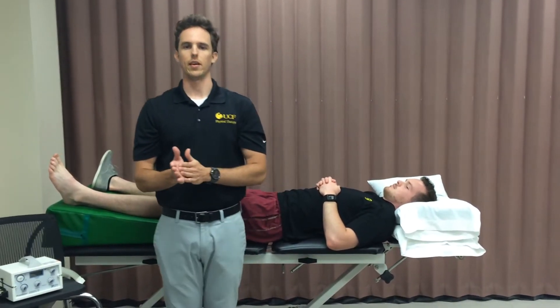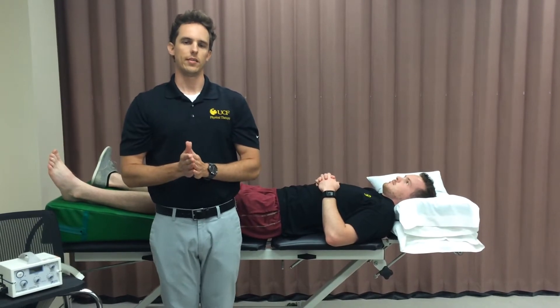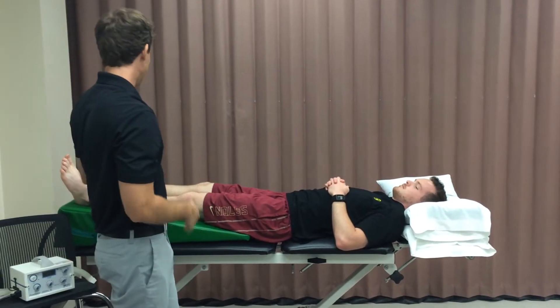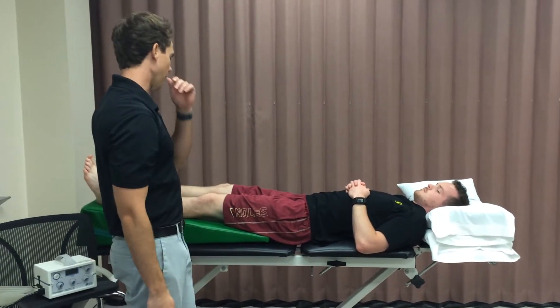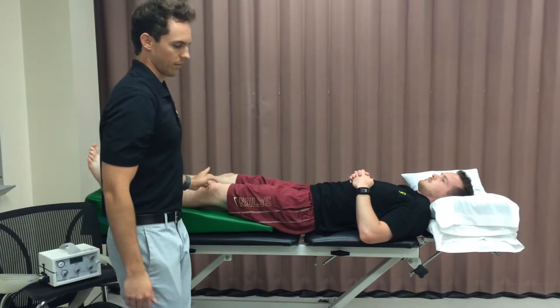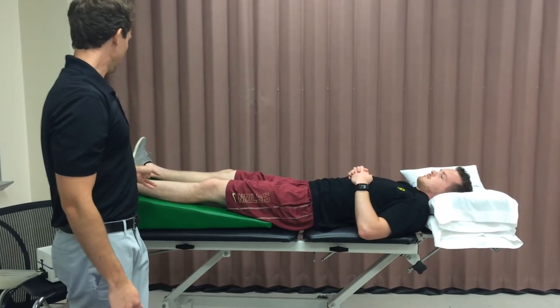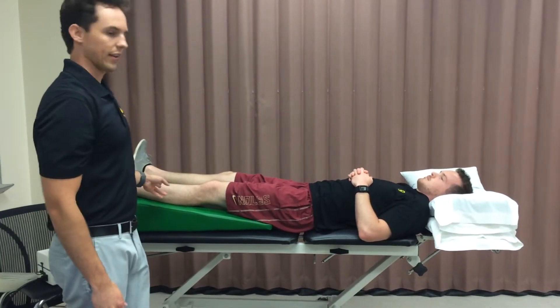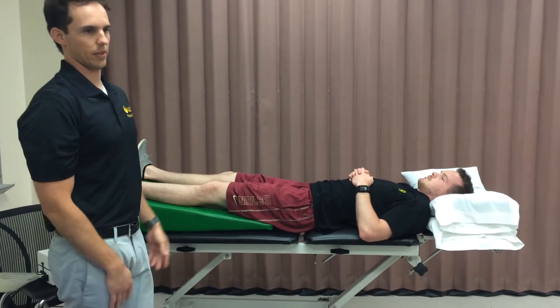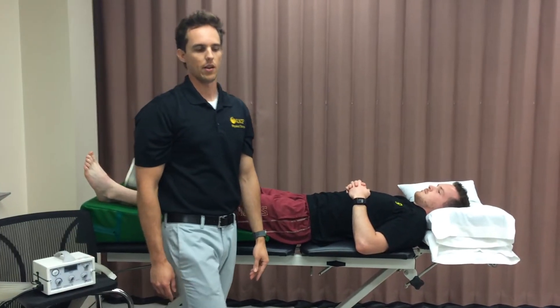What this compression device will do is help increase the venous return through the leg. Therefore, it helps prevent venous stasis in this leg, ultimately reducing his chance for deep vein thrombosis.